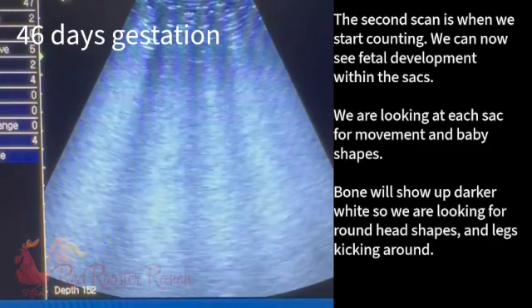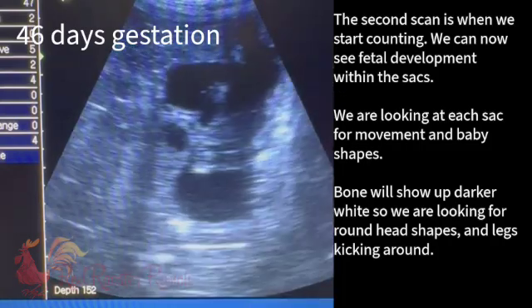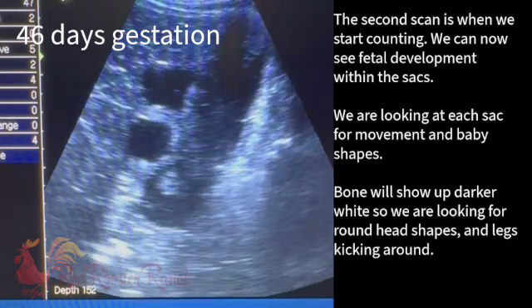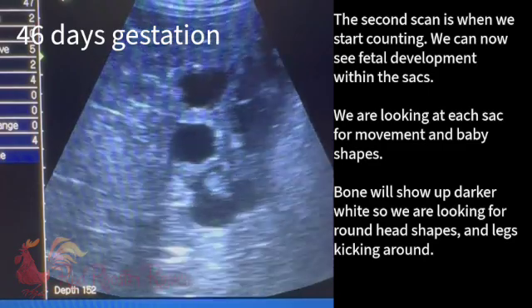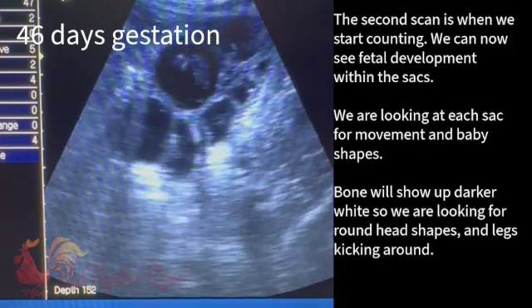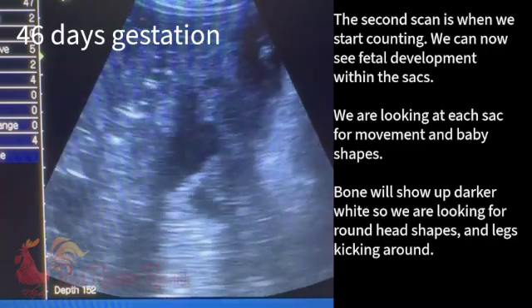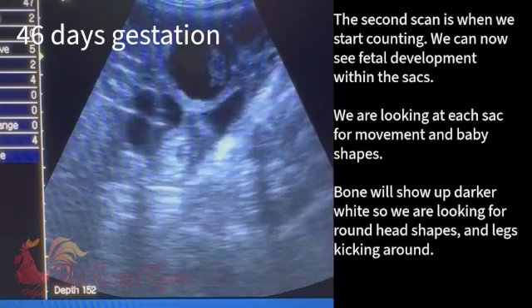One, two, three, and four. I'm really trying to see into that sack, so I'm going to go a little lower, get a different angle. So if we were just counting sacks, we would be tempted to count that. In my experience, I feel like there's almost always one extra sack. At birth we definitely see those extra sacks — all that extra fluid, and the placenta having its own sack with lots of fluid coming out.